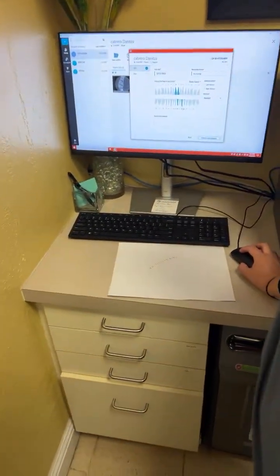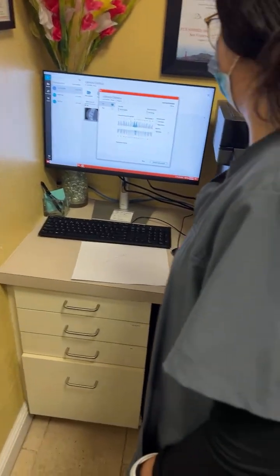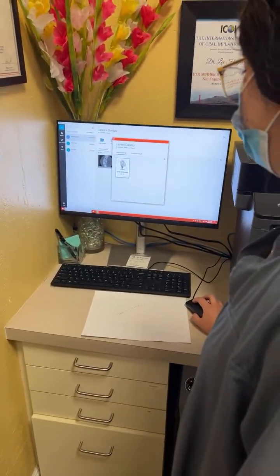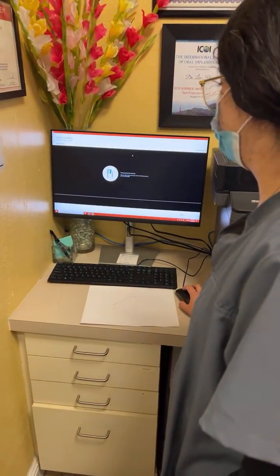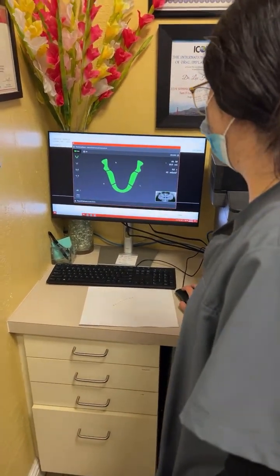Oh, so because the doctor wants to take a 3D, you're doing a scan request. It's a little different. So hit just capture. Capture. Oh, capture. And then hit that. And now it's going to give you the... Oh, scan request is something else. Yeah, that's if you're trying to request a patient scan in advance.